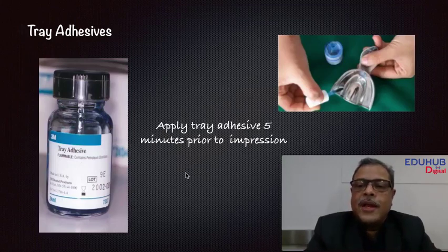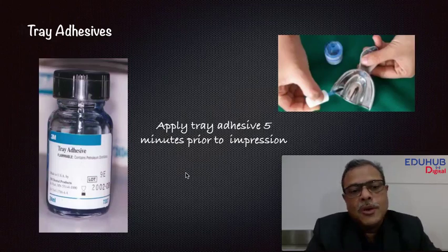So it's very important that it gets adhered properly to the tray base, so that there is no lifting of the material from the tray at any point. The interlocking system of perforation is good for a relatively less rigid material like alginate, but when it comes to a more rigid, stronger elastomeric material, you will definitely need to use an adhesive.